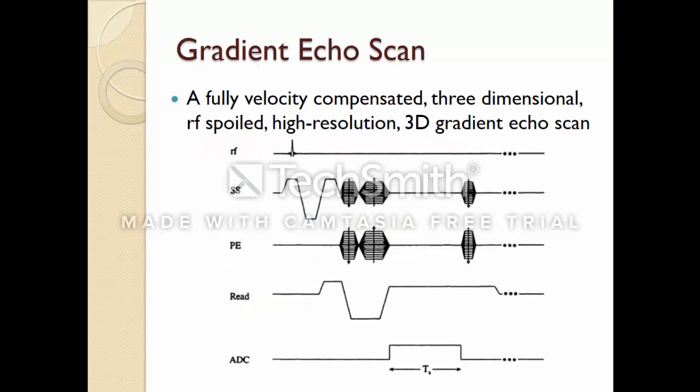Before I go further into susceptibility weighted imaging, one should understand completely the gradient echo scan. Like in any other imaging method, one should first create the transverse magnetization, and then an RF pulse is produced, as you can see here in the picture. In order to create the transverse magnetization, the first RF pulse is produced, which tips the longitudinal magnetization, partially or completely, into the transverse plane. That depends on the magnitude of the tip angle.